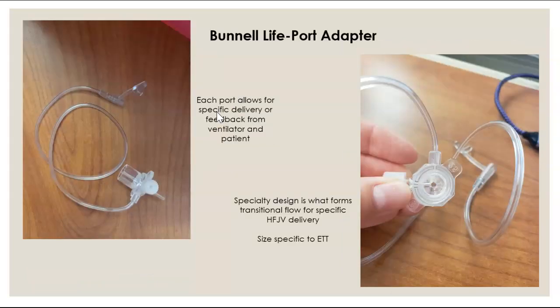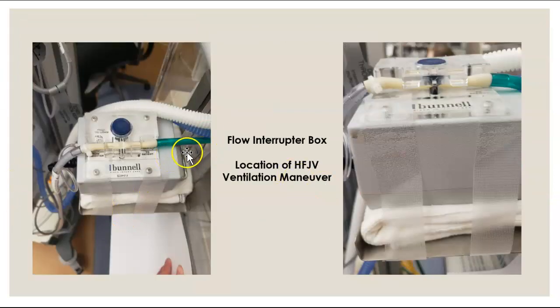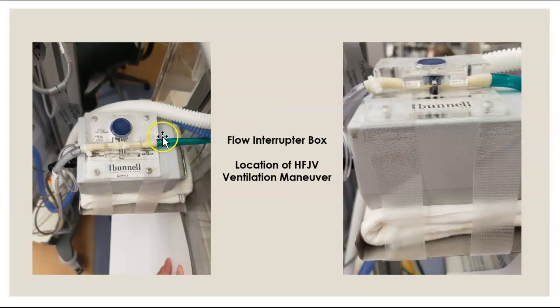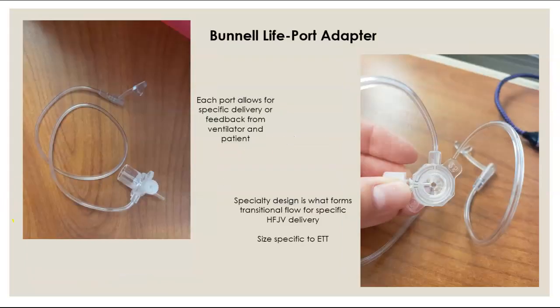Next is the life port adapter. This allows for specific delivery and feedback to the ventilator and from the patient. So this piece goes, let's go back to the flow interrupter. Up here, oh, it's kind of hard to see, my apologies. It attaches to the flow interrupter so that we get continuous feedback. And then this piece right here that I'm holding screws off and is where the end of this green tubing for the flow interruption and high frequency delivery is inserted. Right there, so that we get the high frequency in and get reading out.